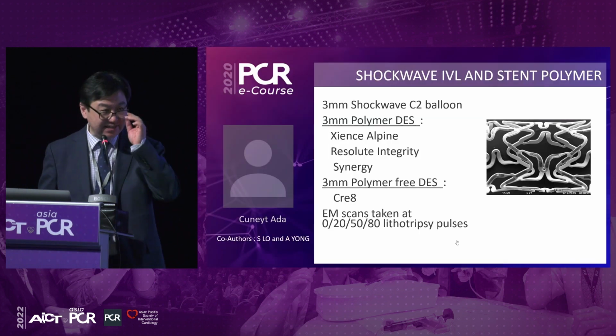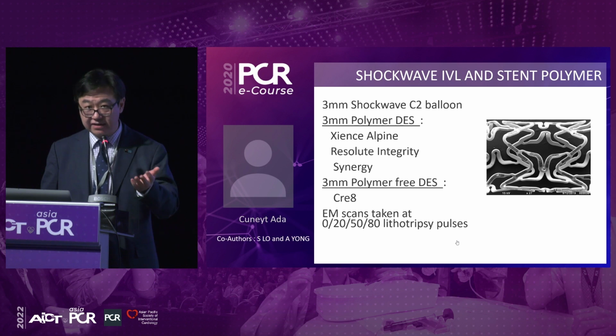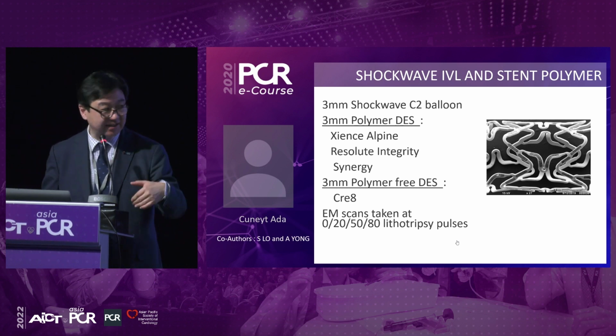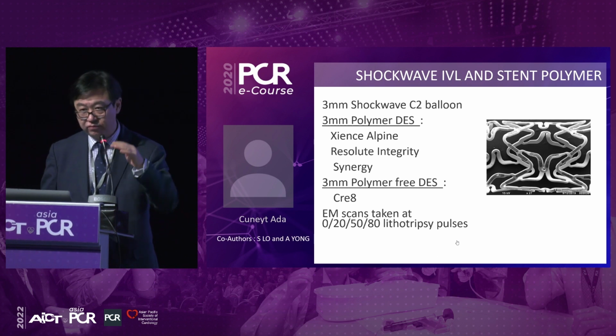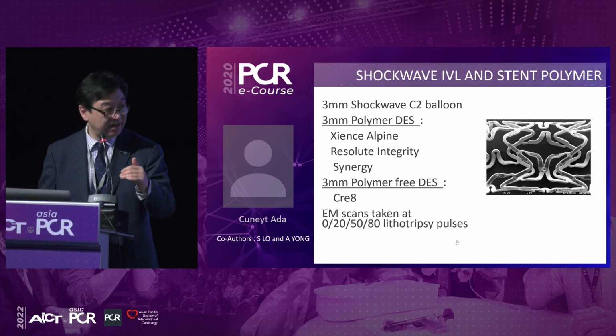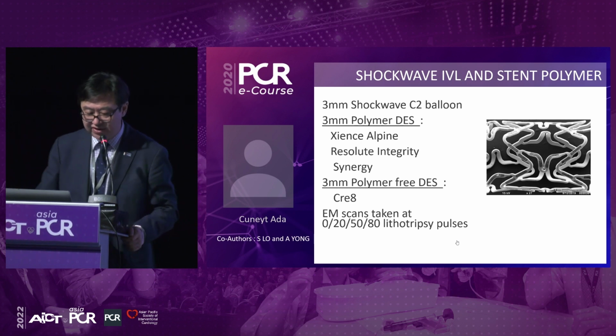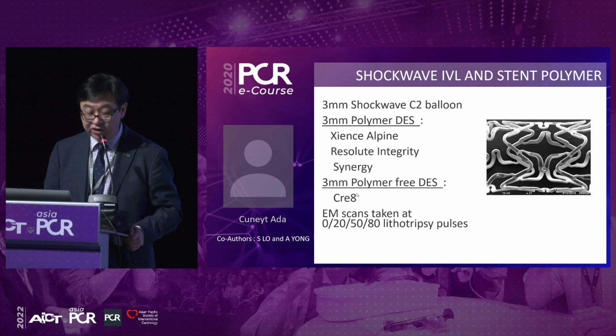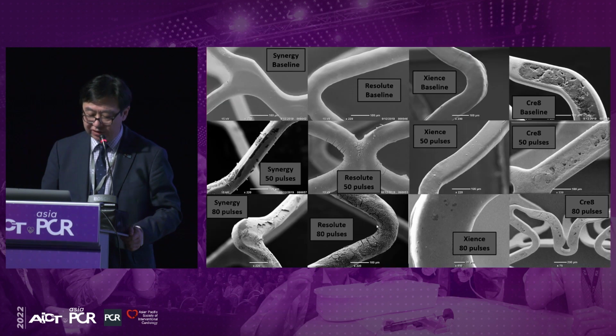Now, we've done some studies about, this is if you get stuck doing normal angioplasty, no imaging, no shockwave, but it's after the stent goes in, there's talk of some attenuation of the effect. We did something about, does it remove the polymer? We did a little study, this was abstracted 2 years ago at PCR, where we actually did EM studies of a various number of stents, polymer ones, Xience, Resolute, Synergy, and non-polymer, and shocked them at 0, 20, 50, and 80 pulses and looked at EM.